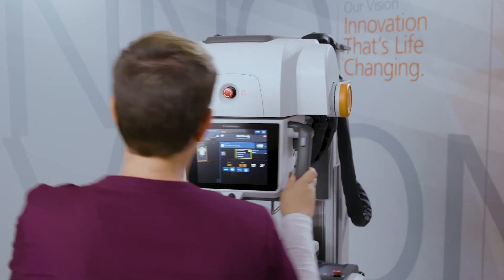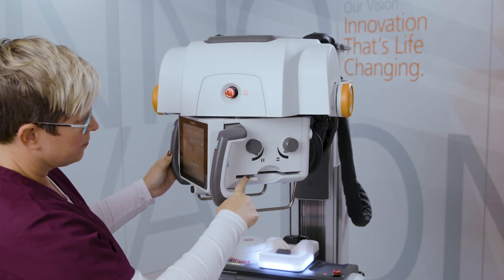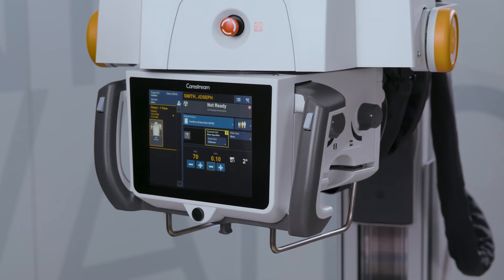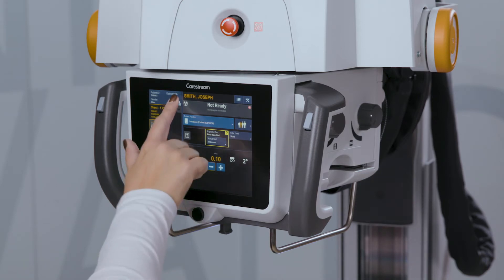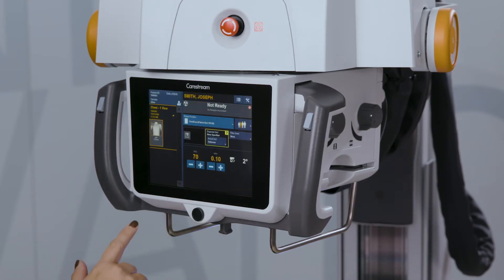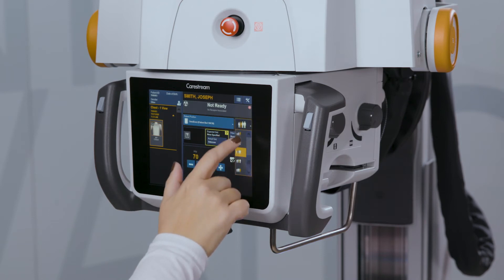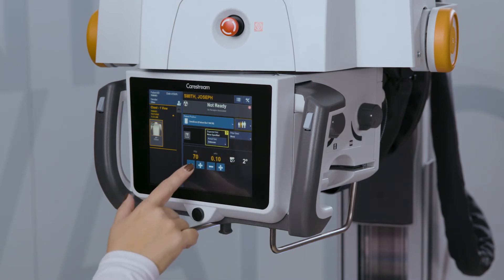There is a slot for additional filtration and a space beneath the collimator for an optional DAP. The tube head display has many of the same functionalities as the main user interface and thus becomes a secondary work zone. Techniques can be adjusted or copied from a previous study, images can be previewed, and exposure settings can be adjusted.